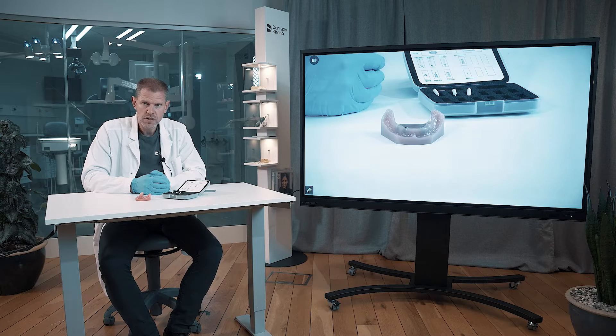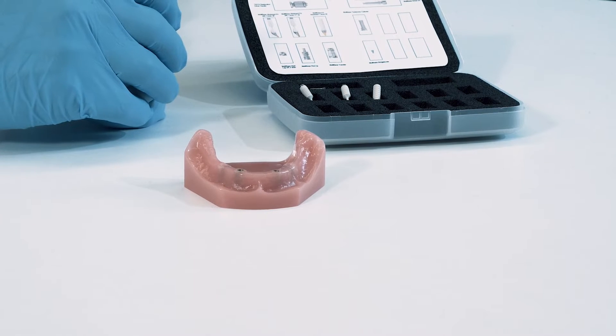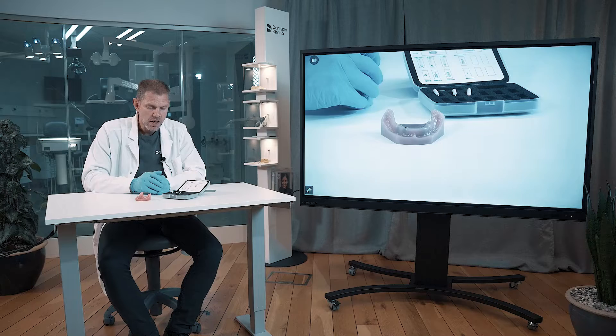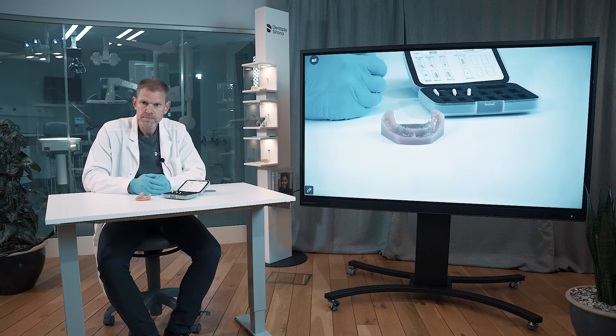Here we are in the SmartFix concept restorative hands-on session, where we put focus on the actual abutments, the multi-base abutments, and how they fit into this model here, which has four implant sites. On top of the abutments, what you can place and how you should work. So a very focused restorative hands-on.